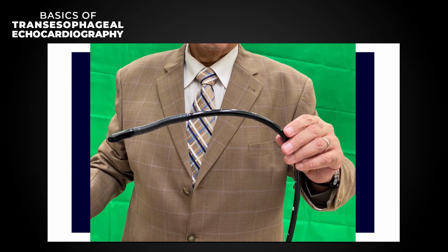Okay, if you want to check for the pulmonary veins, I usually try to get the left atrial appendage. Then I will go to the warfarin ridge, and above this warfarin ridge, we will see the left upper pulmonary vein. If you advance the probe a little bit down and make much more leftward rotation of the shaft of the probe, we are going to have the left lower pulmonary veins.